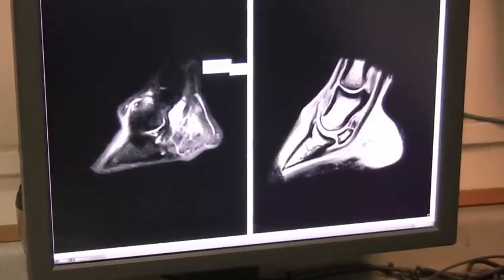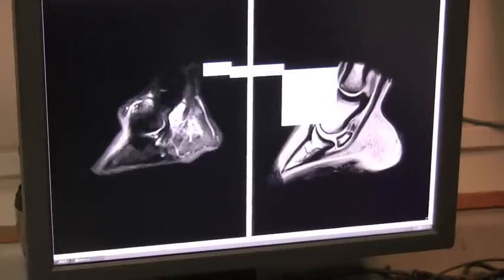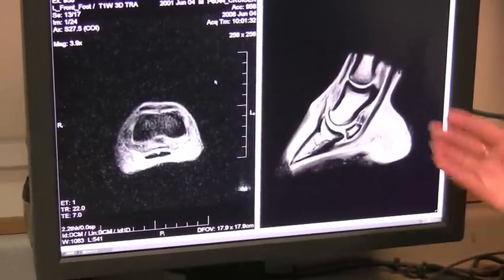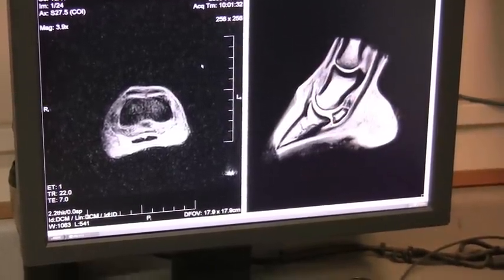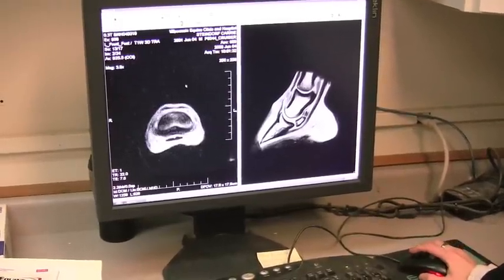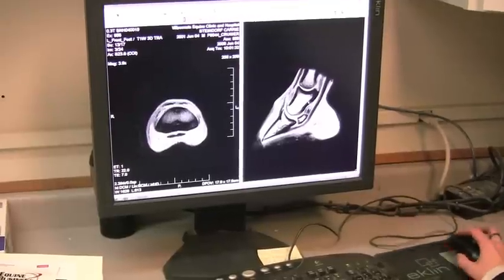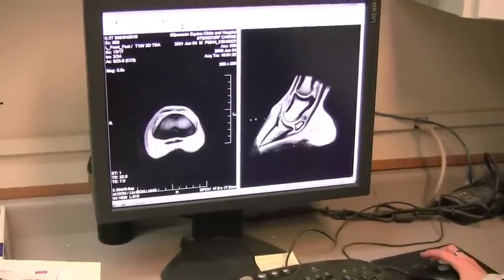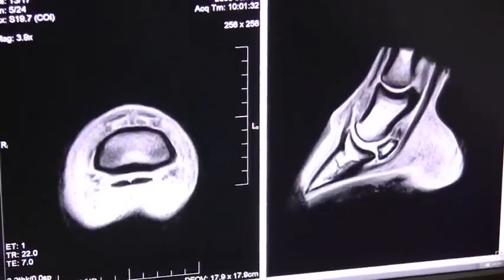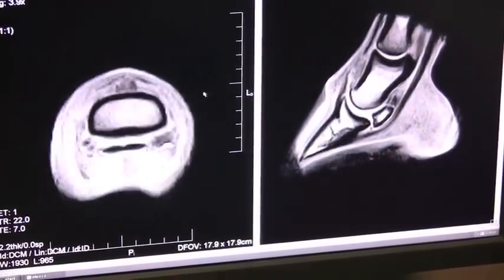We can also complement this particular image with a similar image sectioned differently. So this foot has been sectioned sideways, and this foot has been sectioned parallel to the ground. Now we're looking at cross-sections. Here's our tendon here, and here's our tendon here. And I can correlate depending on where I am — I can say, okay, I'm right about here on this horse, and I'm looking for different changes.